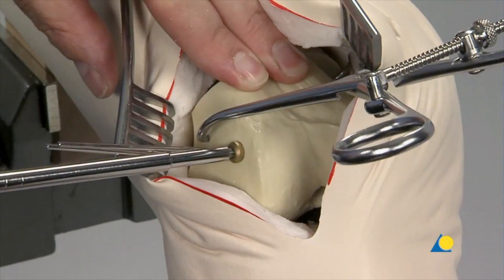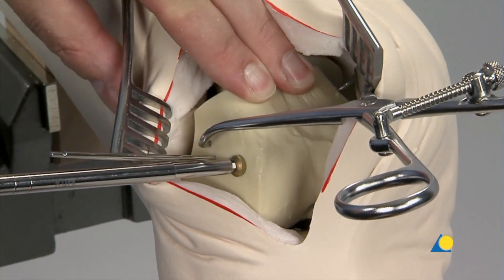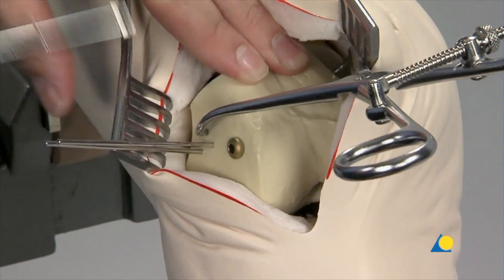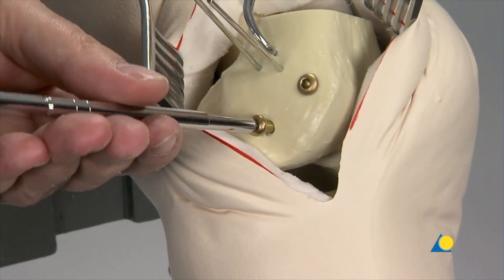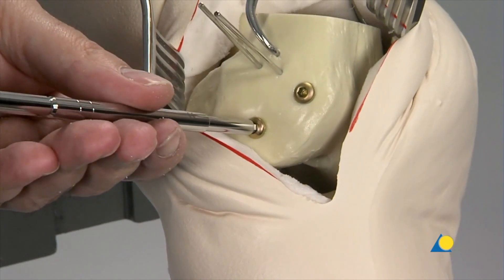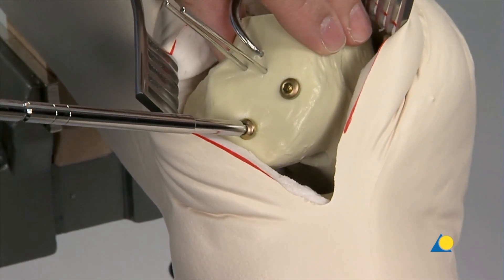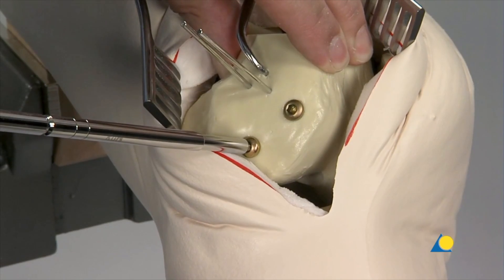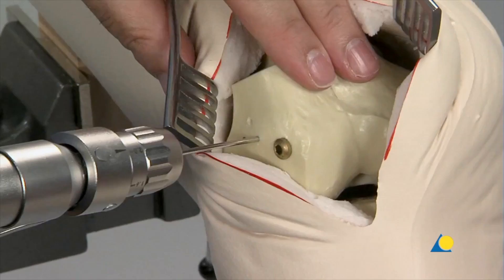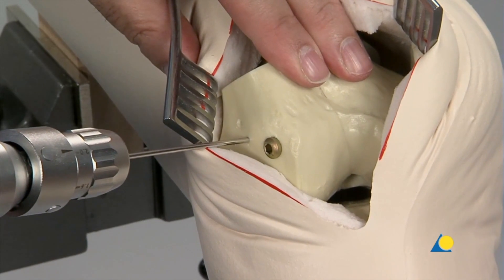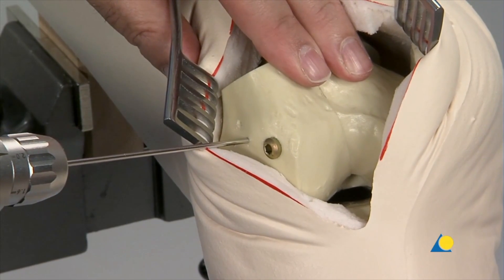The appropriate length 6.5mm cancellous bone screw is inserted. For older persons with bad quality bone, a washer can be added. A second 6.5mm cancellous bone screw is inserted in the same manner to ensure rotational stability. The two K wires are now removed from the joint block.